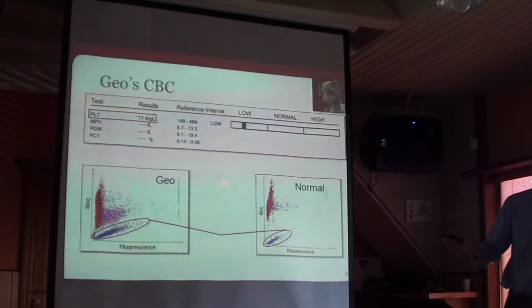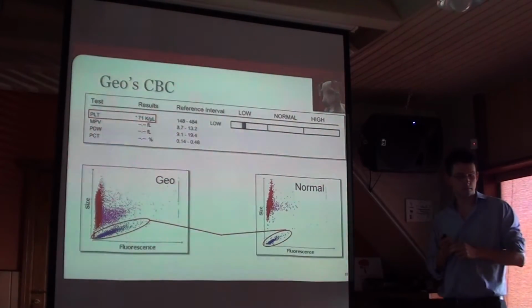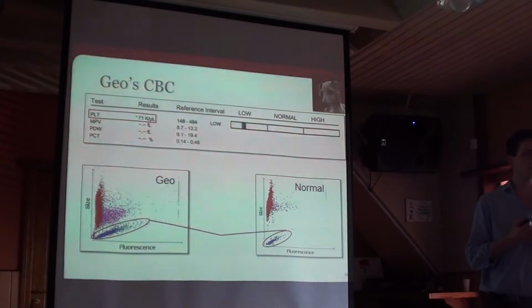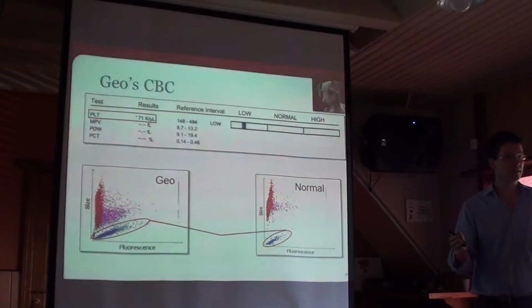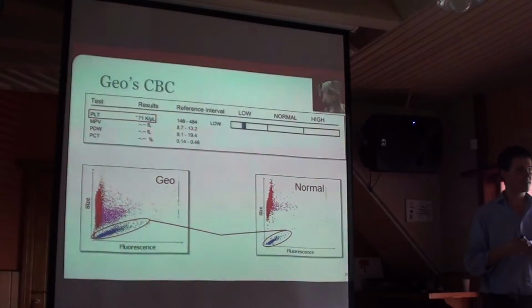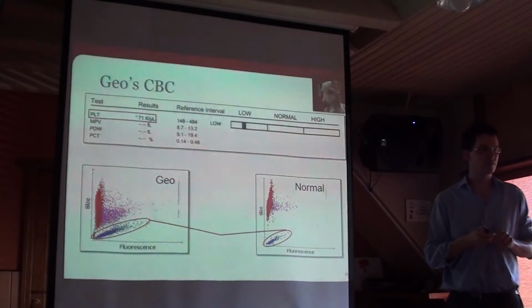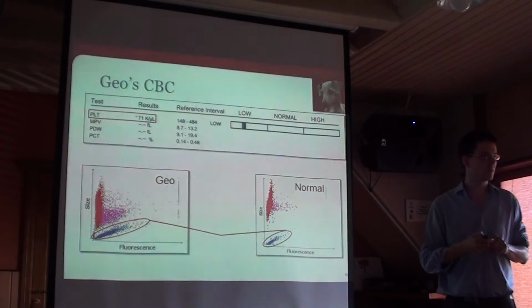That's in direct contradiction to the number that we see up above. So the typical response of a vet to see a low platelet concentration on whatever analyzer they're using is to say, oh, what an awful analyzer.